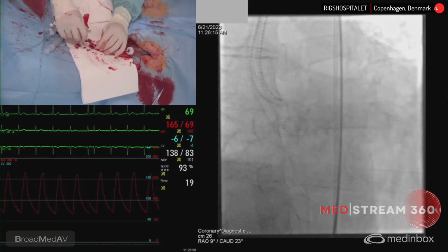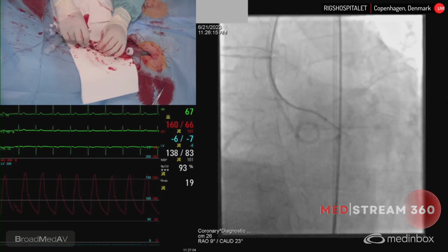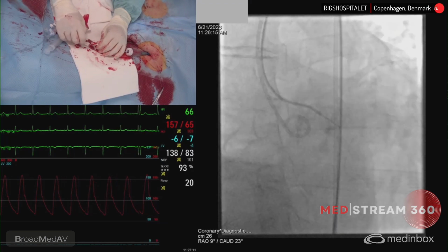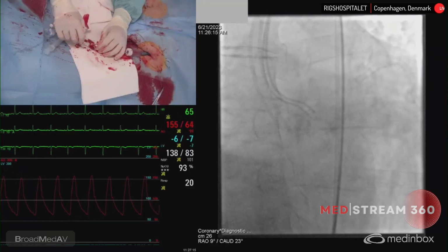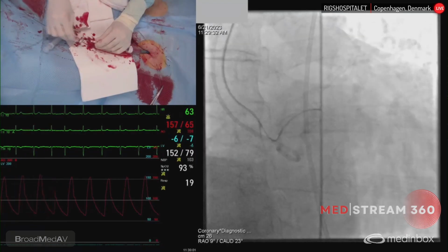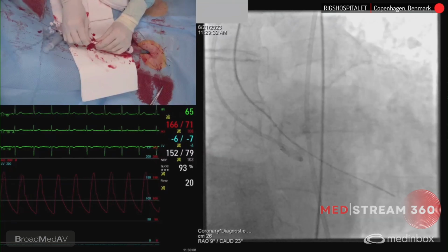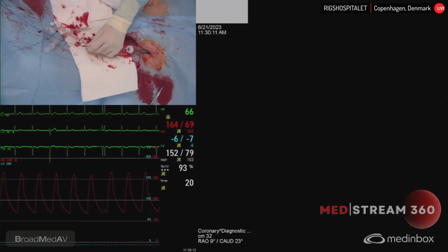There's some horizontality in it. I think we miss some high, but then sometimes the L2 doesn't make it necessarily better, you know? Yeah, it's more indeed higher up. It's actually a very vertical annulus, which is a bit tricky, I would say, for valve placement too. It was a little lower than we thought, but the horizontality is the problem here. Now go really deeper in with the wire.